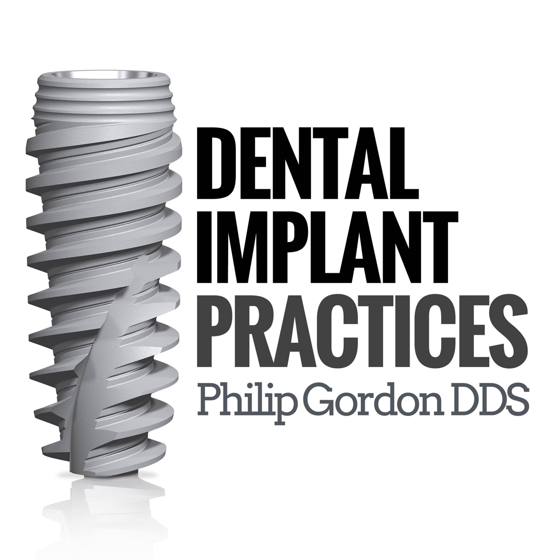Let me just give you a little rundown on the history of the Replace. Like I said, one night I woke up out of my sleep. During the preceding day, if you get your implant glasses on, these kinds of patients run like schools of fish. I had four different patients that needed a single implant in the aesthetic zone. That would be 7, 8, 9, and 10.